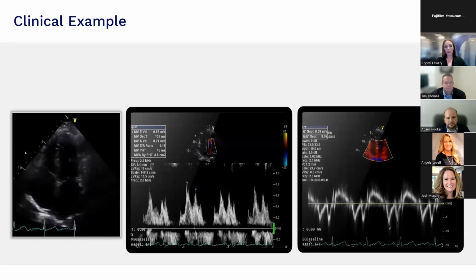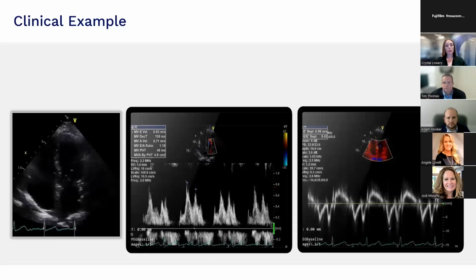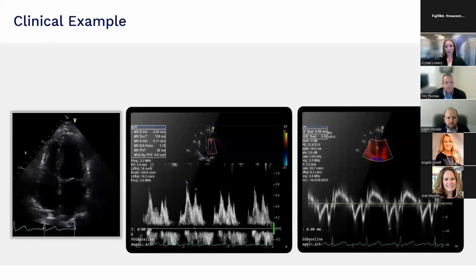There are a number of parameters that we take as sonographers to determine diastolic function. We look at several measurements of Doppler. We do a lengthy process of structure and function, and often we still won't get conclusive information. So with our algorithm, what we'll do is just look at that single 4-chamber image at the level of the pixel, and we can detect HFpEF from that alone. And that's one way to really augment your diagnostic capability.